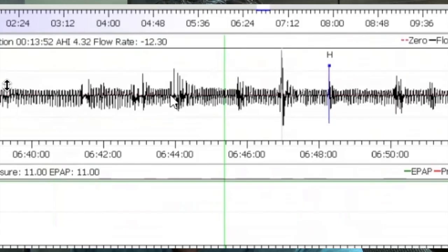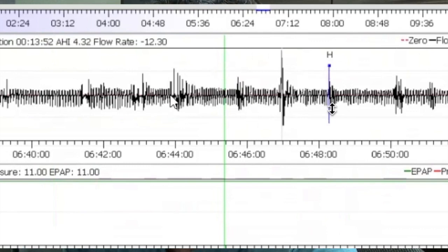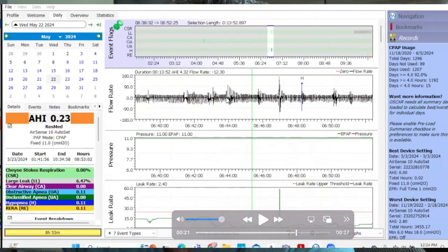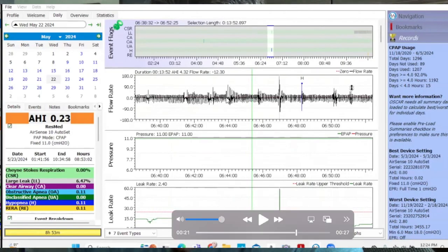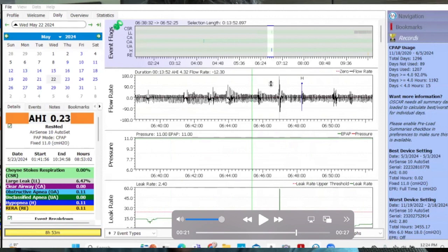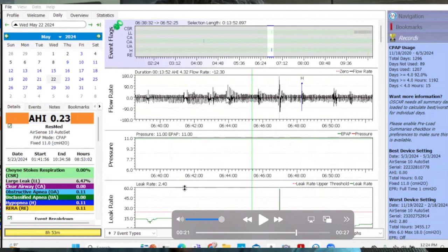Every one of these spikes up here is an awakening, waking up every single one of these. And if we look at it, the window is probably roughly maybe 15 minutes, but in here you can see that there is one arousal, two, three, four, five, six, seven, eight, nine awakenings in probably a 15 minute period. I think we can all agree that's a lot.